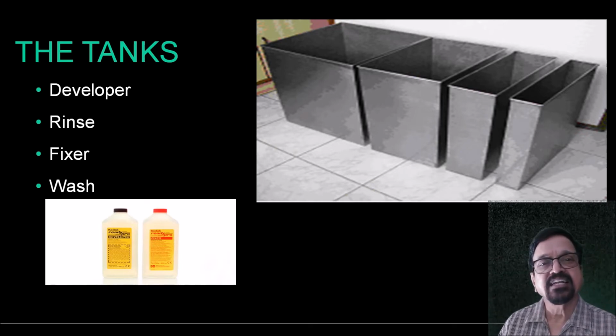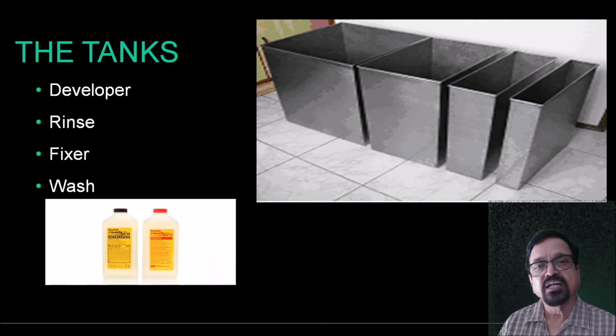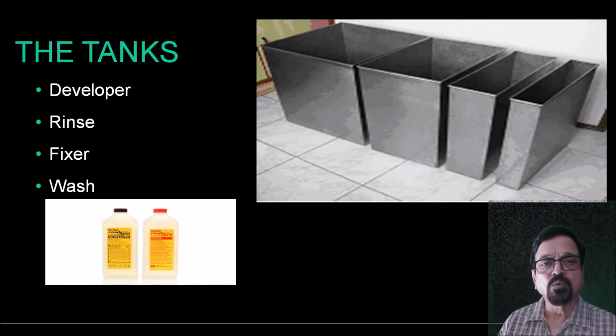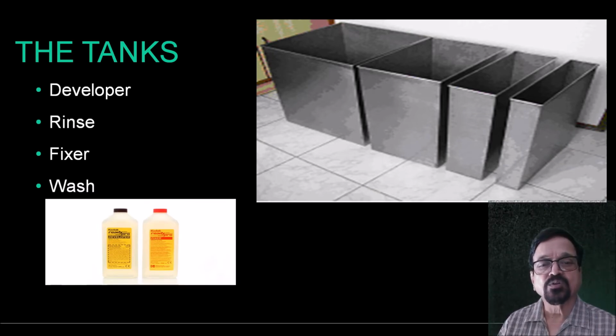Versus the rinser, which has no problem, can be used, and doesn't have a life expectancy. And third is a fixer. Fixer also, as far as possible, should be changed in a certain duration. If you keep it too long, then the films take too long to fix. Number one, they sometimes don't get fixed properly if they are urgently removed. And third thing, films for preservation are not good, because after a few days they get brown or orange.